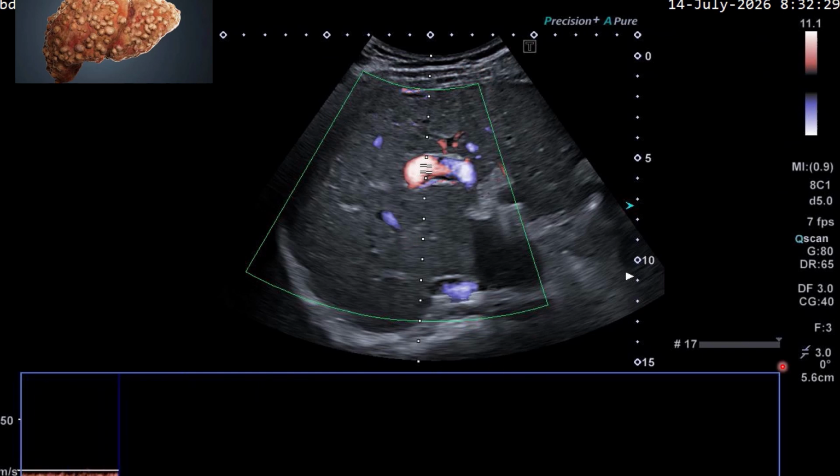So hepatic fibrosis is one of the early signs of liver cirrhosis. So scarring starts to happen, then it will either resolve back to normal. So this is mild scarring that is here. So we hope that this liver is going to resolve.